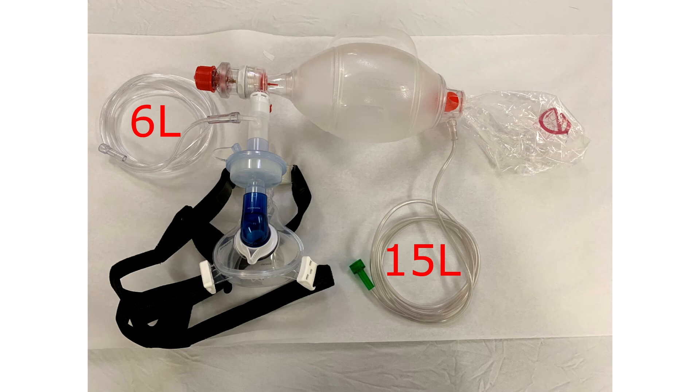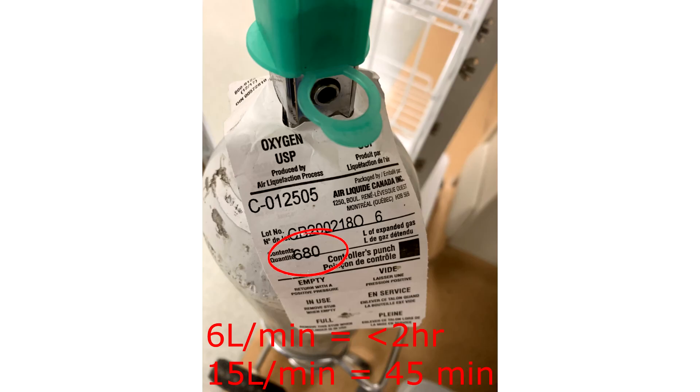The fact that the setup also needs two oxygen sources poses a logistical issue to and from the EMS rig. In our department, we've got tanks of about 680 liters of O2 when full, and that's going to provide you with a little less than two hours running at 6 liters and less than 45 minutes running at 15 liters.